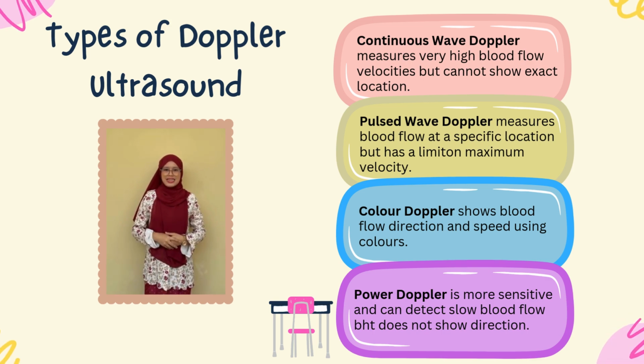Next, I will explain the types of Doppler ultrasound that are commonly used in medical imaging. There are several types of Doppler ultrasound, and each type has a different function depending on the medical condition being examined.